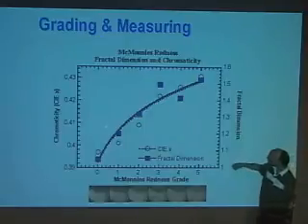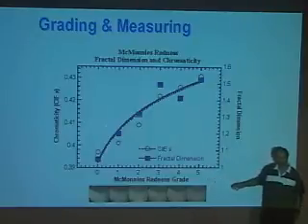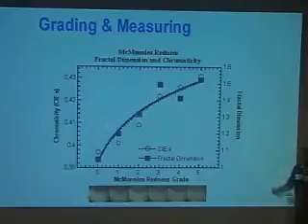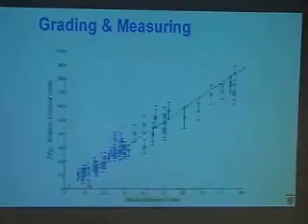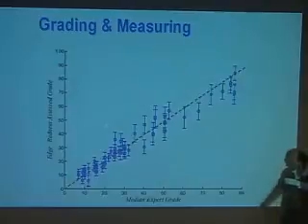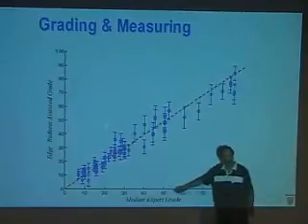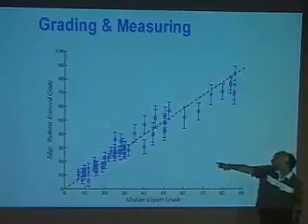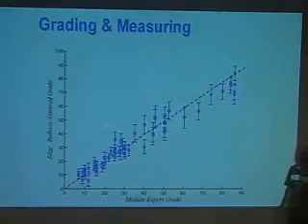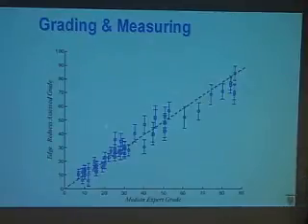And you can see, though, that we can characterize those images of those eyes in an objective way. And that's what we're aiming for, to characterize them in a variety of ways. This is a different experiment done, again with Paul Fegut. Here is our grade of redness judged by clinicians. And there is an aspect of the characteristic of the blood vessels obtained from the images. Again, I think I said I did this with Paul Fegut.